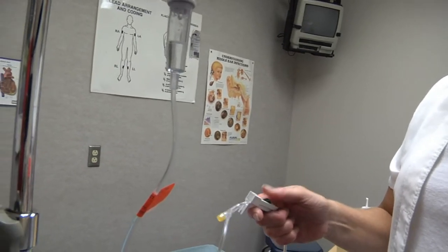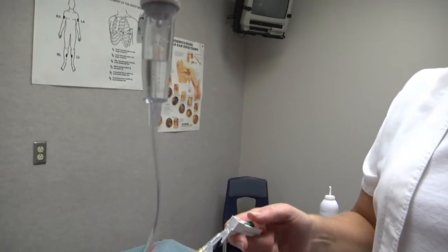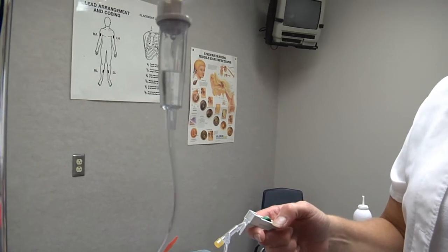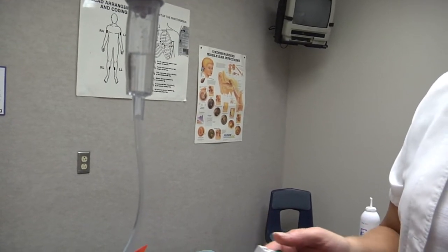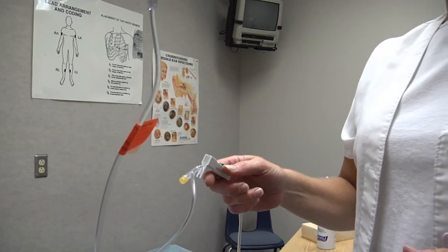Now, if it was running too slow, I would just do the opposite. I would increase it to the prescribed amount. And depending on if it's running too fast or too slow for too long, that would also be an incident report because it wasn't running at the prescribed rate. So if the IV is running at 150 milliliters an hour or faster, then I would need to make sure I come in and check this IV every 15 to 30 minutes. Normally we would check an IV every hour that the patient is running.